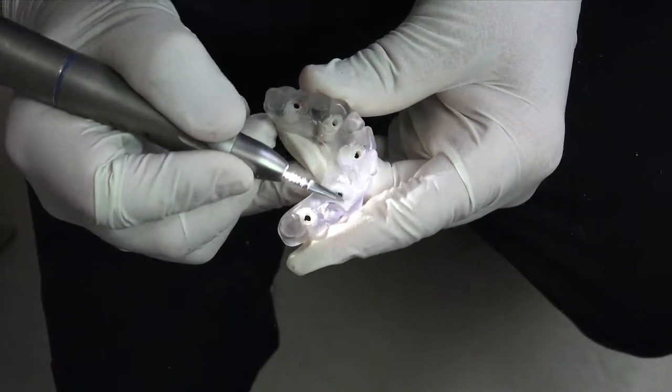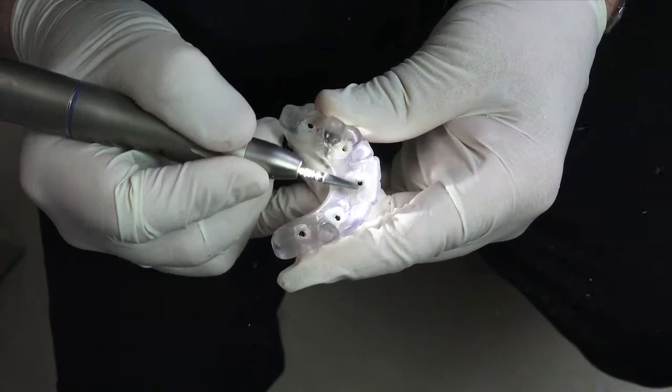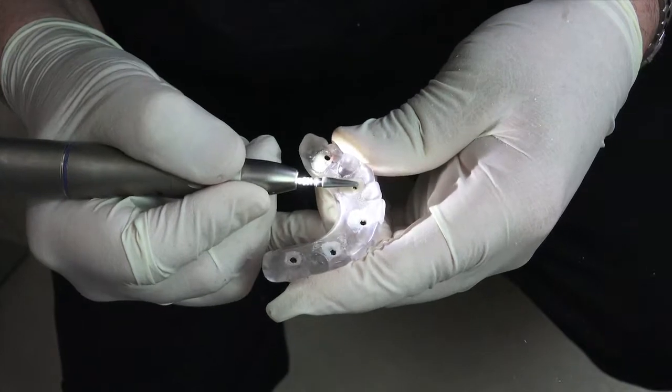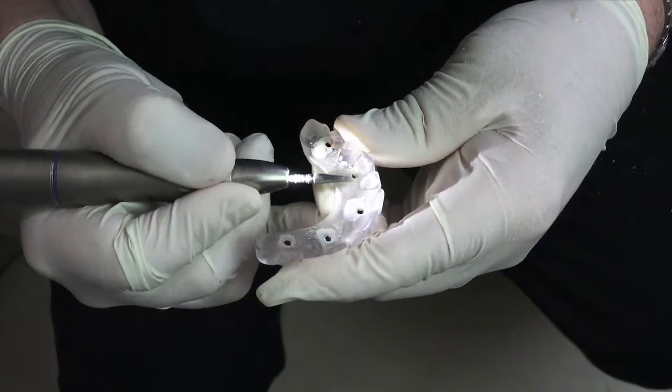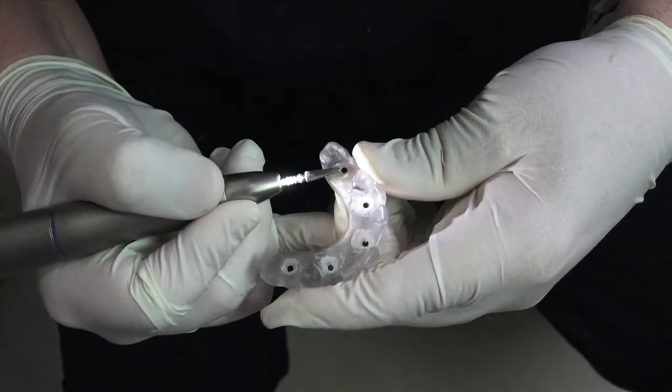Some clinicians will also reduce about one to two millimeters of the tissue side of the clear duplicate bridge. This will ensure space for the light body impression material at the first restorative appointment for the final impression. This may also be done at the first restorative appointment.